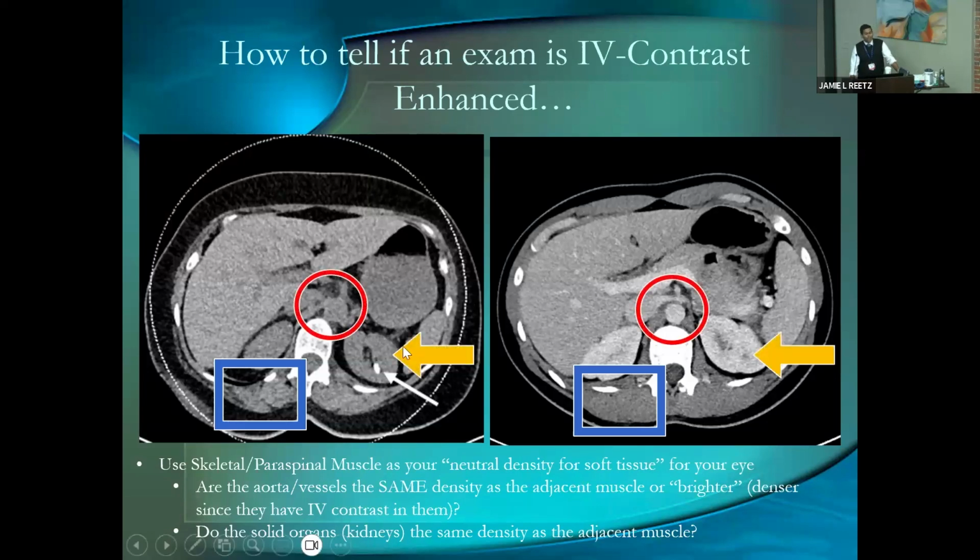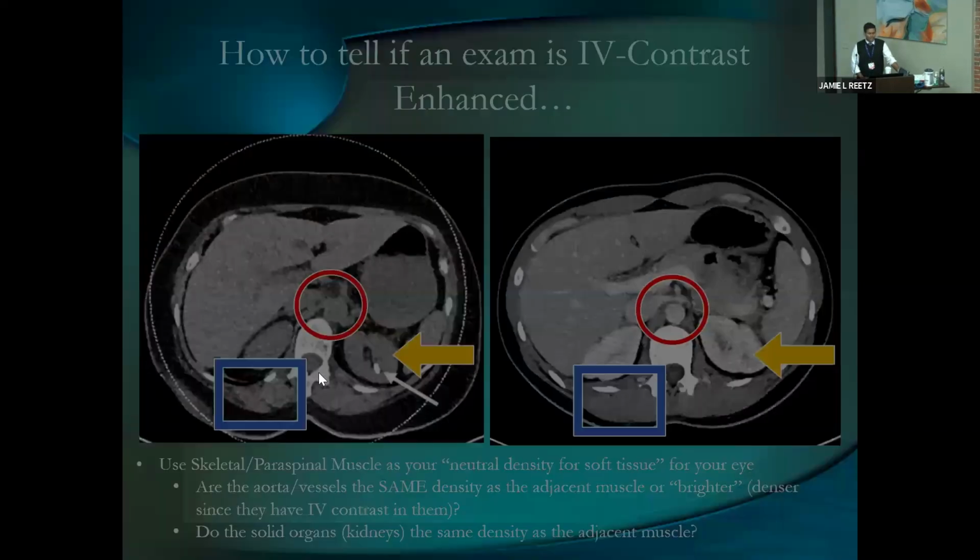And then the other annoying thing is that renal calculi are also bright. So people sometimes say, well, you can't give contrast to look for stones and calcifications. In reality, with modern CT, you can, but we typically still say, let's hedge our bets. Non-contrast examinations looking at hyperdense structures like stones or calcifications are easier because they're going to be hyperdense. So I don't want to give a contrast agent that has a similar density. I want to make it as obvious as possible. So you can see that's the point of that.